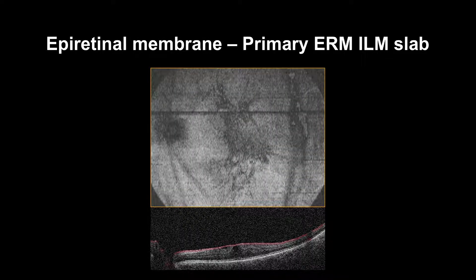The ILM slab may not show any changes, or will show straight or curved hyporeflective folds. However, in more advanced stages where the epiretinal membrane is thicker and causing more distortion, the ILM slab will show more folds in the form of hyporeflective lines covering a larger surface area. Some cases can show a window to the retina due to segmentation artifact.